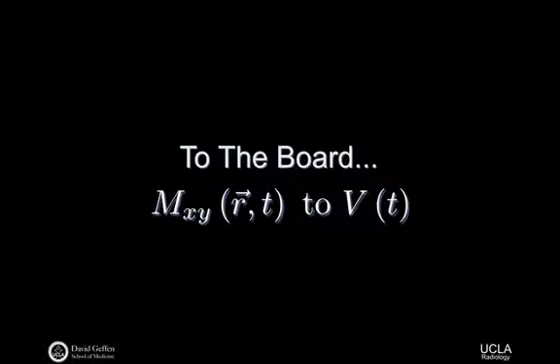And one of our steps today is to get rid of that dependence on the Larmor frequency, to take this whole expression from something precessing at the Larmor frequency down to what we call the baseband, down to some lower frequency signal for getting us to k-space. So we can think about some of these individual terms now. So let's think about just the Mx term, for example. We have Mx, which is a function of space and time. And the time at which we're acquiring the data itself is a period of free precession, right? We might have a gradient turned on, but we're just listening to the signal during a very short period of time. We're not forcing it to precess. It's naturally just free precessing.